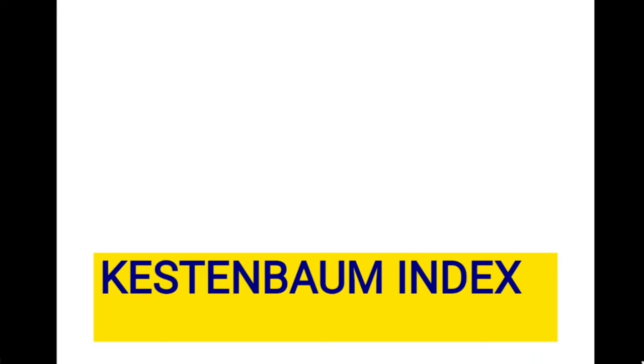Coming to the next important thing, that is the Kestenbaum index. It is not just confined to the glaucomatous optic disc. It is more important when you want to assess the progression of the disc damage either due to glaucoma or due to any other causes. You can even differentiate hyperemia also. So what is the Kestenbaum index?